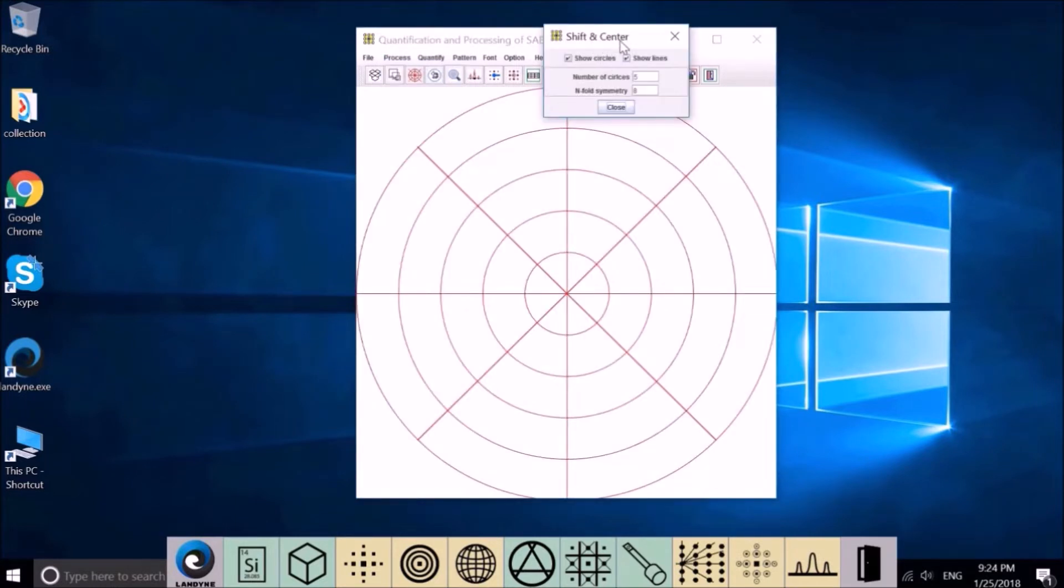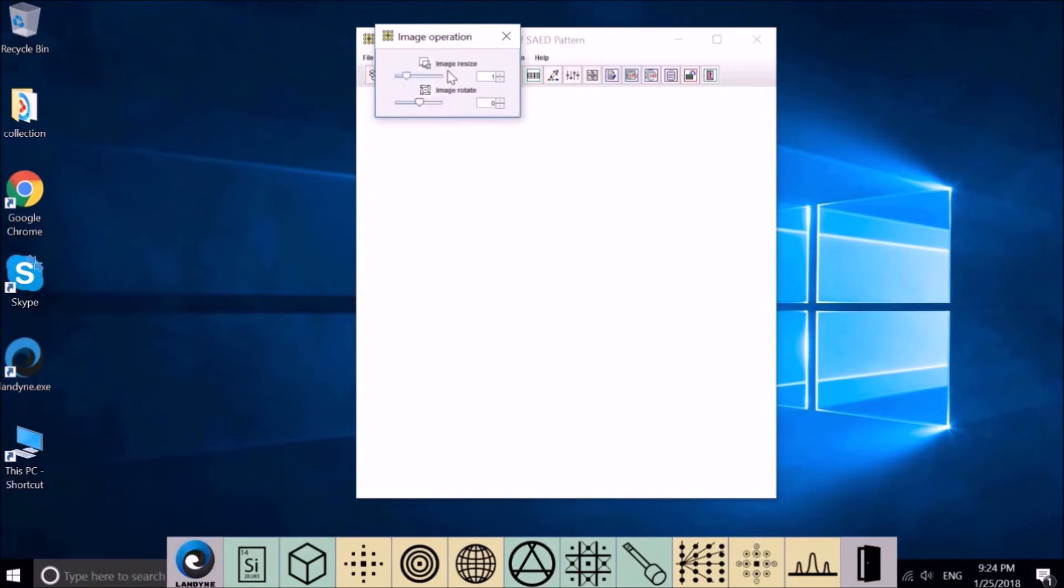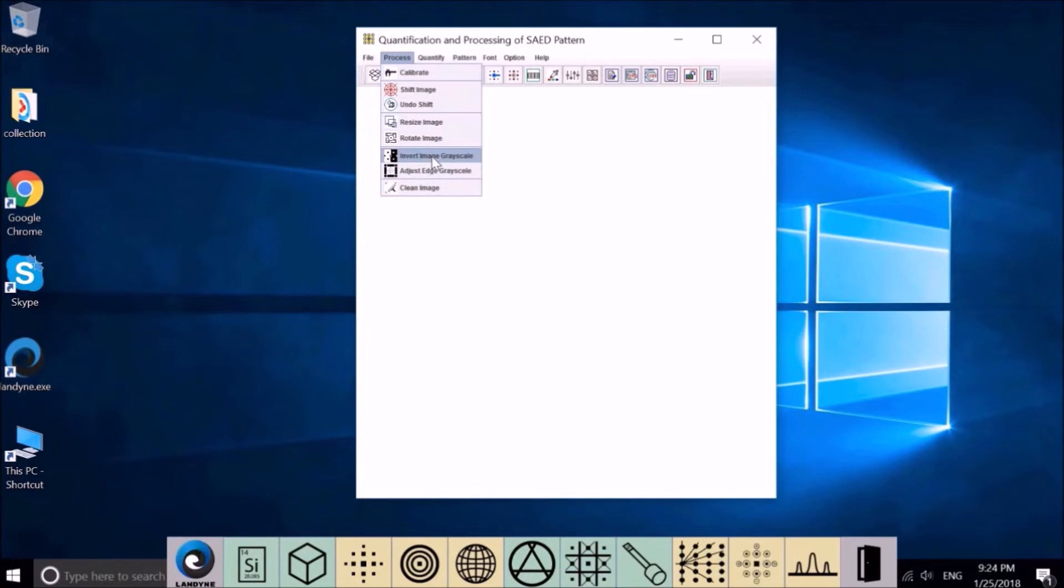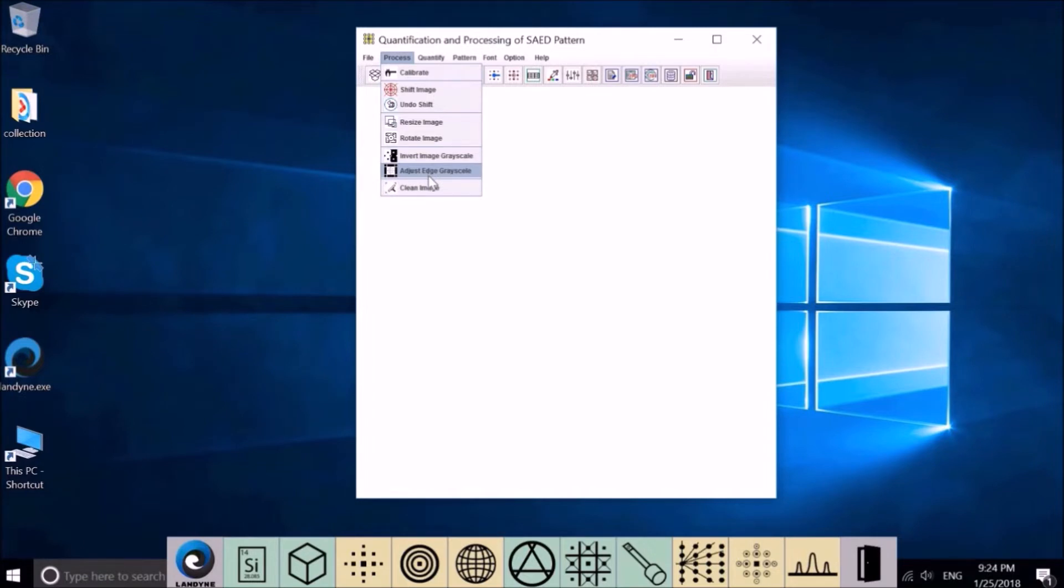Shift and center - move the incident beam to the display center. Resize and rotate image for image processing. Invert image grayscale - turn black background to white background. This adjusts possible leftover edge grayscale. The last one will erase the image.